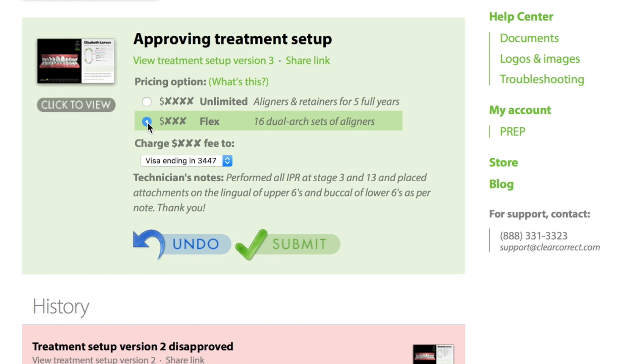Once you've made your choice, click Submit to approve the setup and pay for the case. When we get your approval, we'll start manufacturing the sequence of aligners represented in the treatment setup.